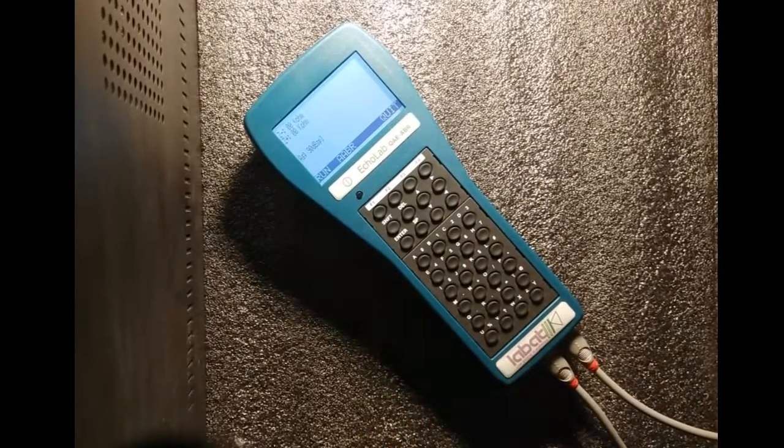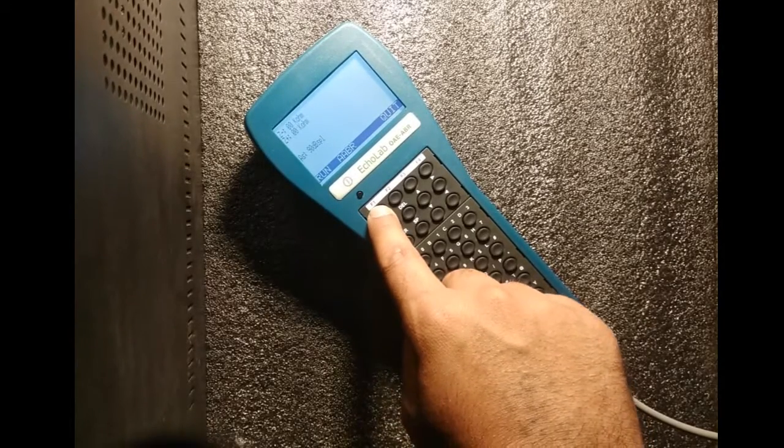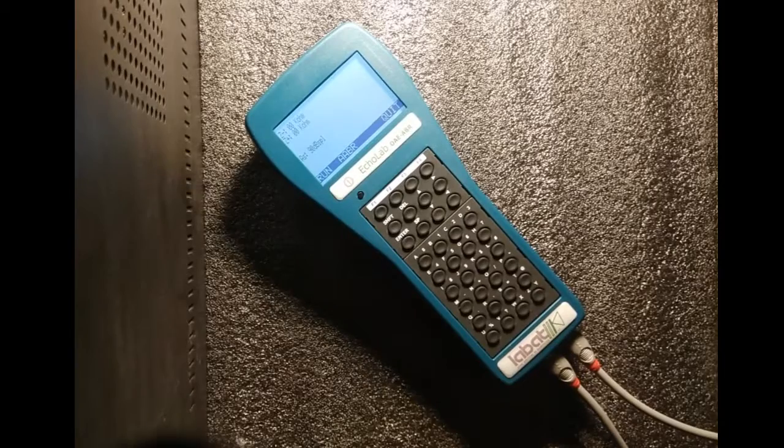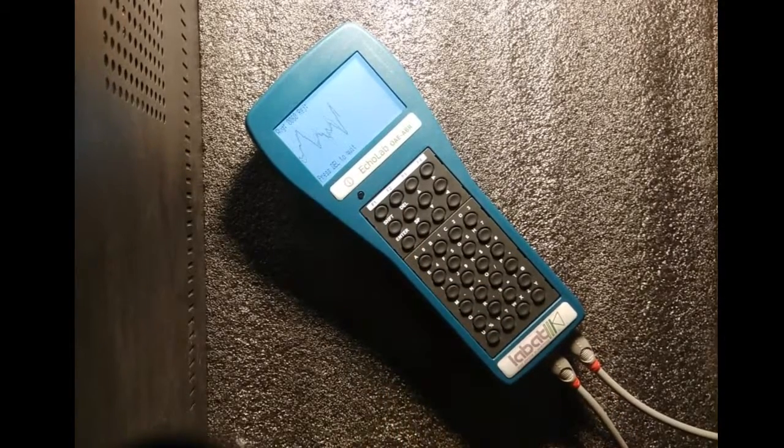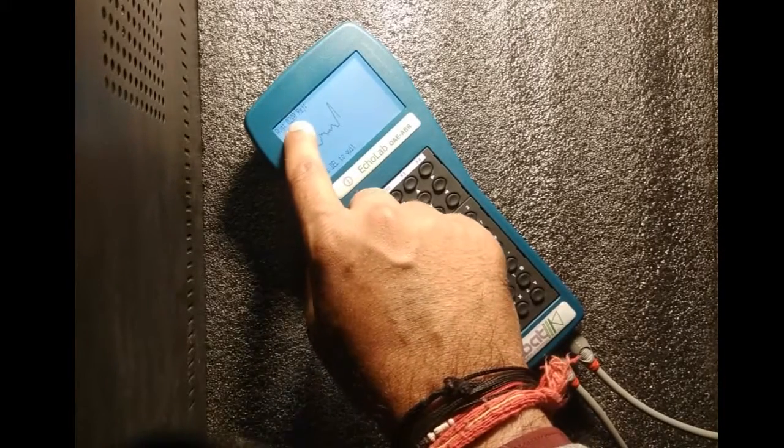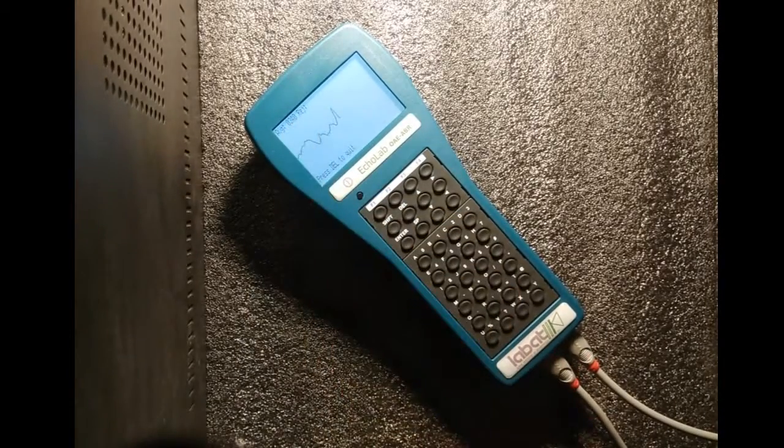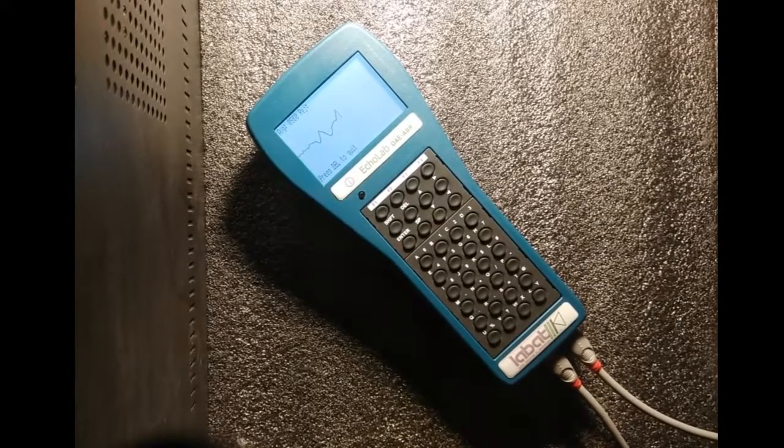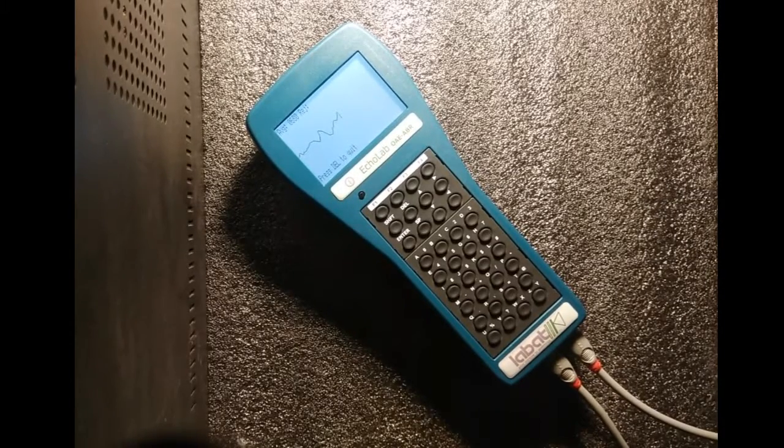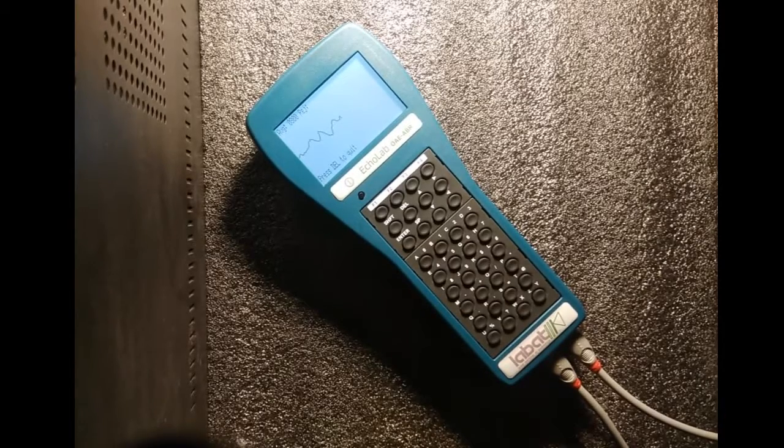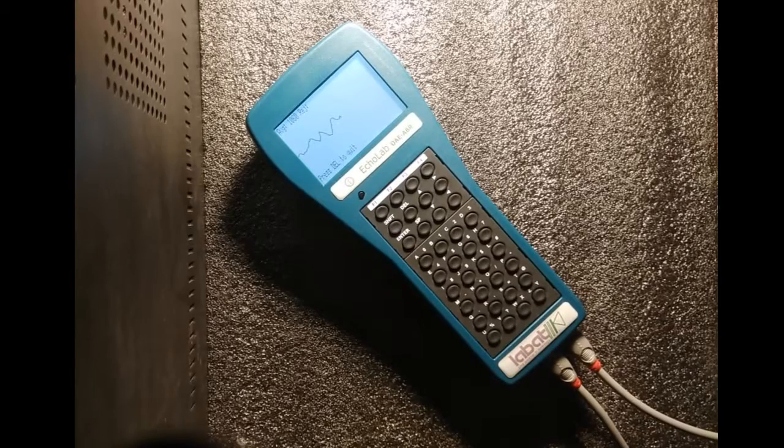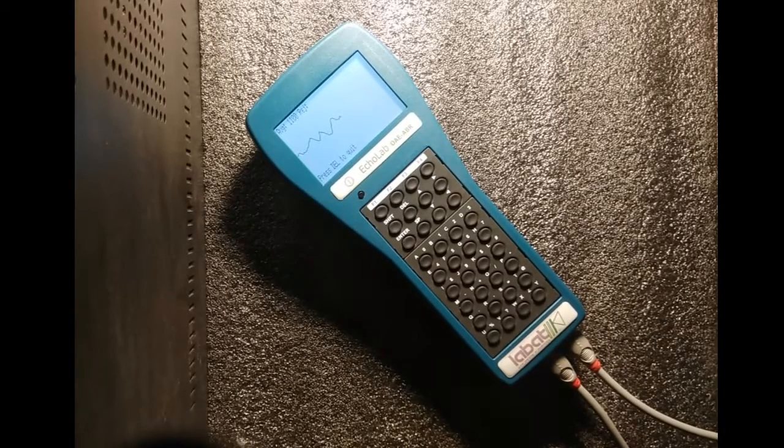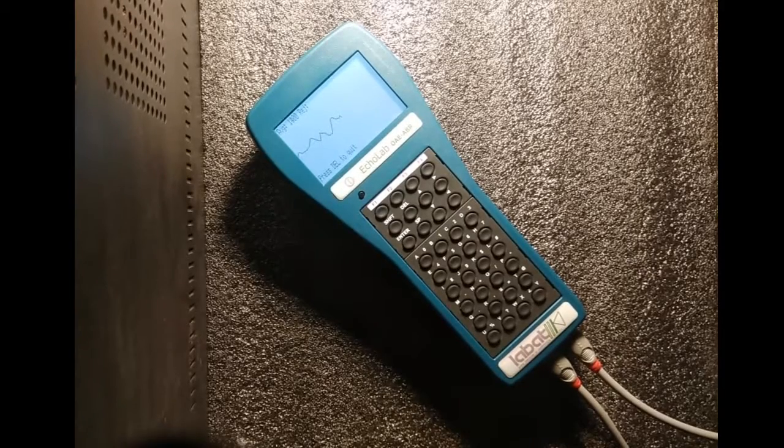Now we will do the ABR test. I am hitting F1 for run. Now the test is in process. You can see the sum value - it is 300 over here and still increasing. It will go up to 3000. The sum is 1300 right now.